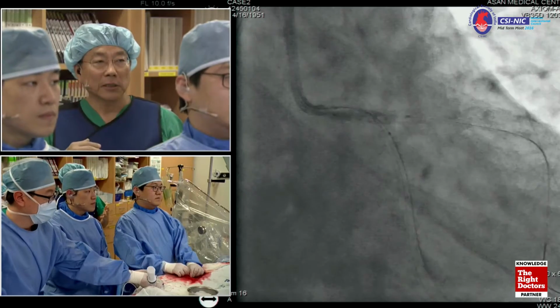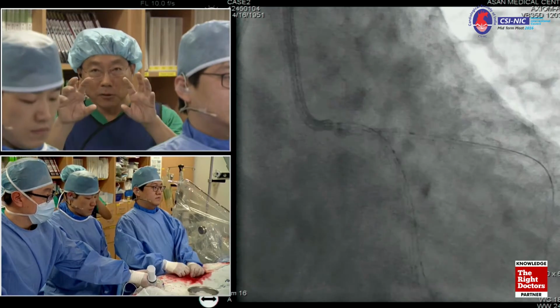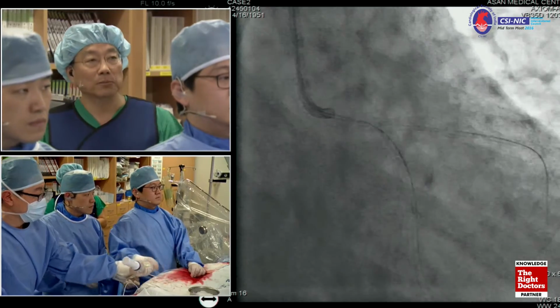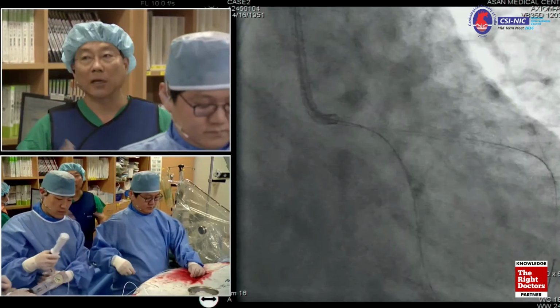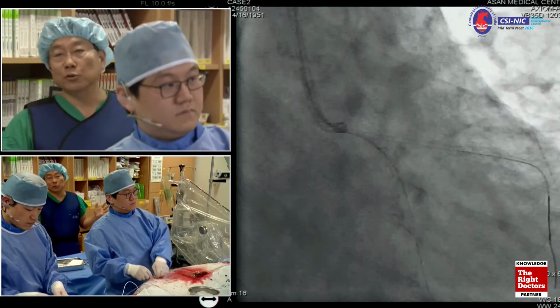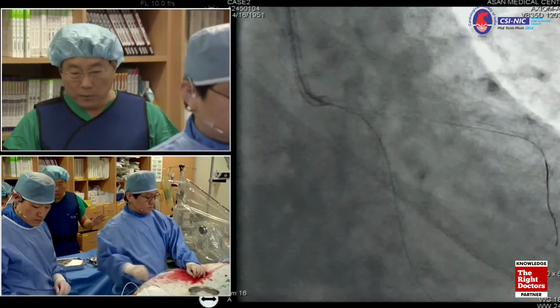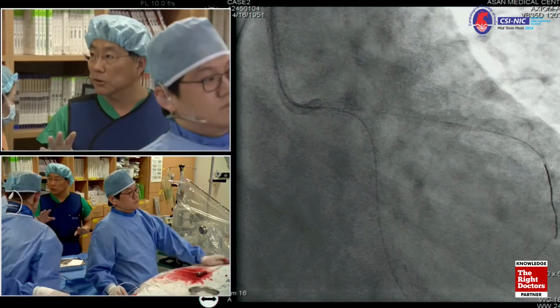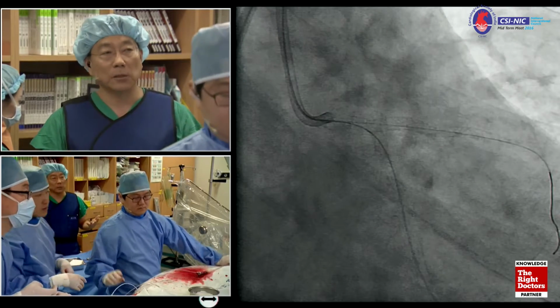Before and after the IVUS-guided, to measure the stent cross-sectional area is the most important predictor for late outcome. That is our message from the 2 cases. And whatever you choose, the 2-stent technique, I don't worry about that. Still, the single stent is good rather than the 2-stent complex stent procedures.